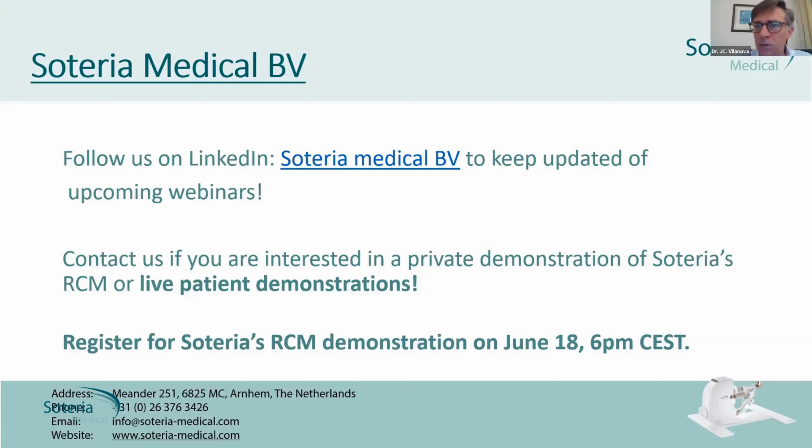And there was one question here: who is performing these biopsies? And of course, it's the radiologist because he's the one that is taking care of the MRI. So in this case, there is no doubt that we are the radiologists performing the in-bore biopsies, as you already said. Yeah. But there's always a collaboration with the urology. Of course, because the indication has to be discussed, and most of the times it has to be the urologist that is going to provide the request of a prostate biopsy. Otherwise, there is not going to be any request.